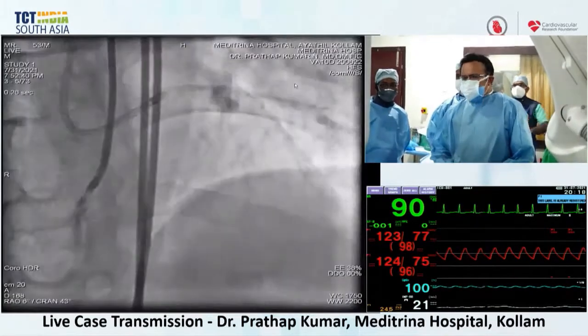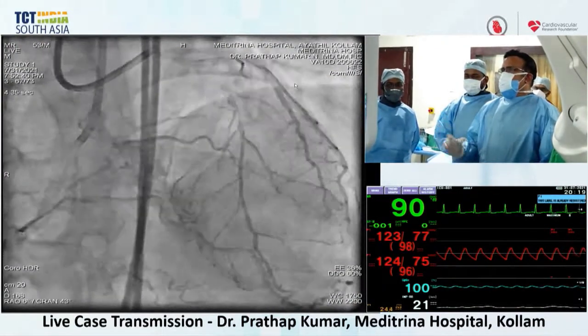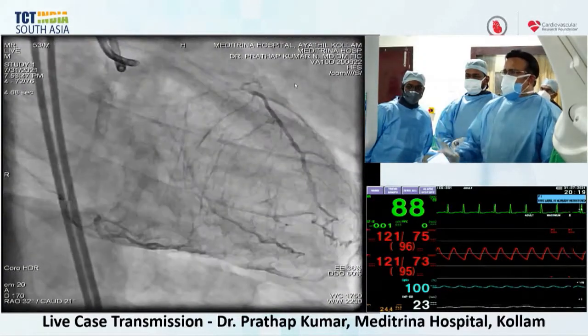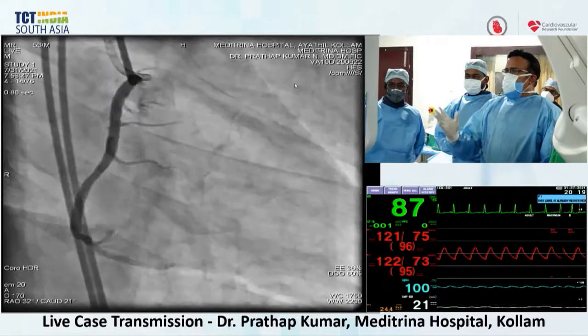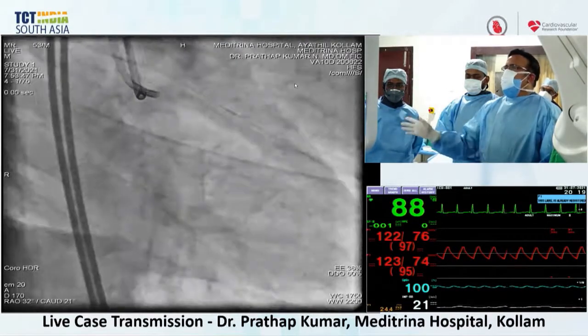Can you just show that? Excellent connections. Next shot. Excellent connections and multiple collaterals. Actually, it can create a problem also, but at the same time it is an excellent connection. Almost all the connections are collateral CC3 or CC2 at minimum.